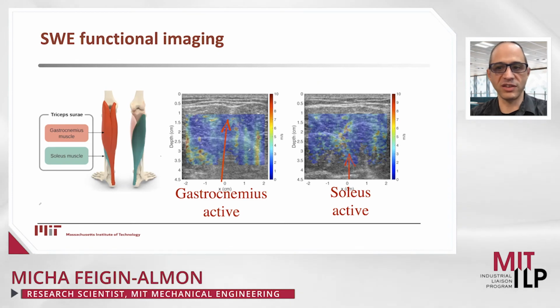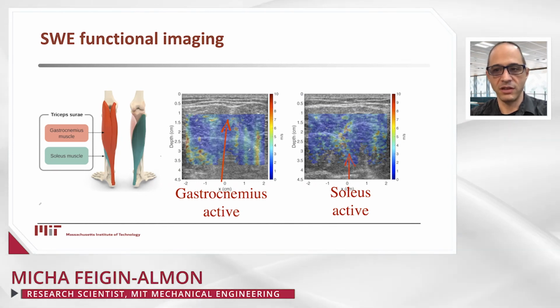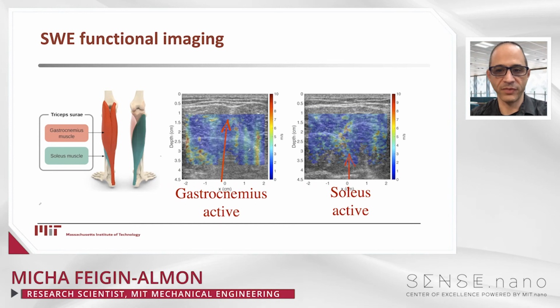Currently, the closest thing to the state of the art in the field is shear wave elastography. When muscles contract, they stiffen. The closest physical value related to our intuitive notion of stiffness is the Young's modulus. Shear wave elastography measures the shear modulus, a value that under assumptions that are almost true for soft tissue, is strongly correlated with the Young's modulus, and thus used to approximate it.